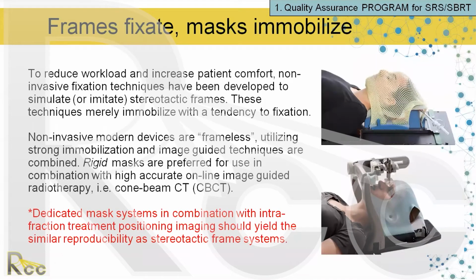So I mentioned this before, frames lock something into position. Masks don't do that. Masks immobilize. They make sure that the person doesn't move, but that doesn't mean they're going to be positioned in the exact same way. There's always a little play in masks, and knowing that play for your mask system is important.